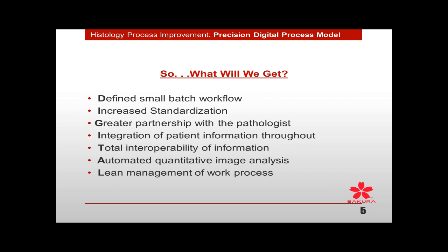So what do we get? Defined small batch workflow. You're going to increase standardization at every step. Keep ratcheting down the standardization because you need to remove the variation. You want the most consistent product going in and out of your digital process at all times. You will develop a greater partnership with your pathologist. You have to. You have to have a very close relationship with the person who's going to be the ultimate reviewer of that data, the digital slide.